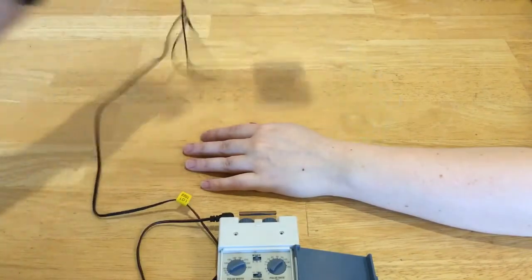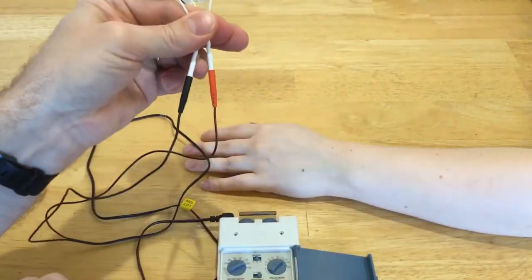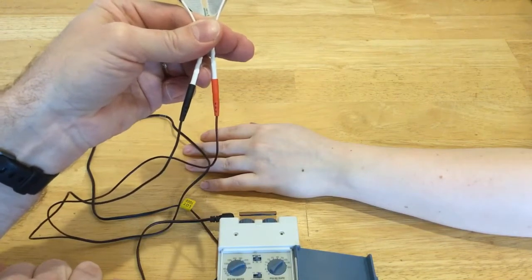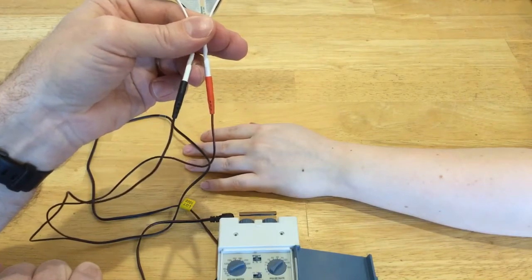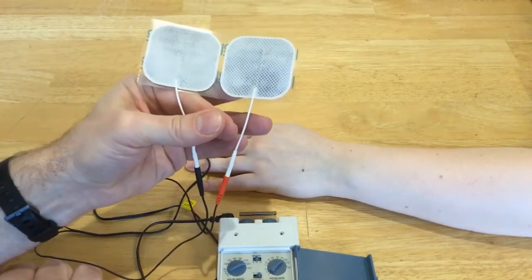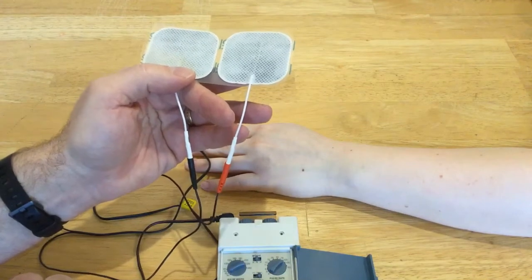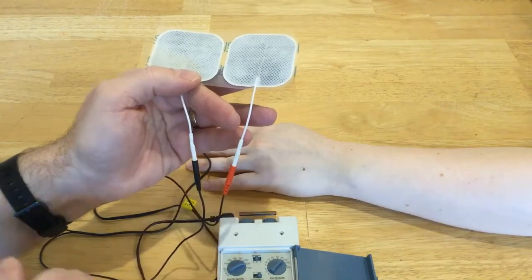You'll also notice that with this machine, you have one red lead wire and one black lead wire. That would lead you to believe that they do different things, but they do not. Most TENS is a symmetrical biphasic waveform, and so both electrodes will spend an equal amount of time being the primary cathode and the primary anode. Another way to say it is both of them are equally active at nerve depolarization. So there's really no difference between the two electrodes.